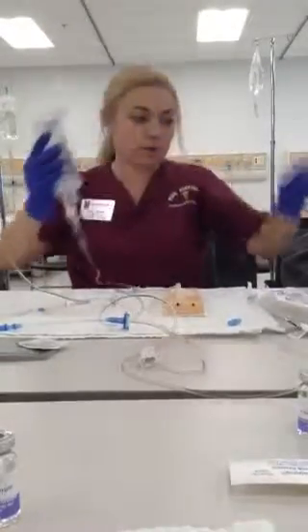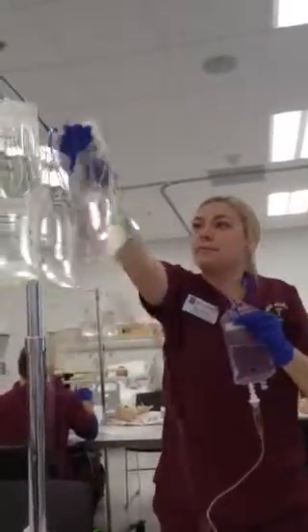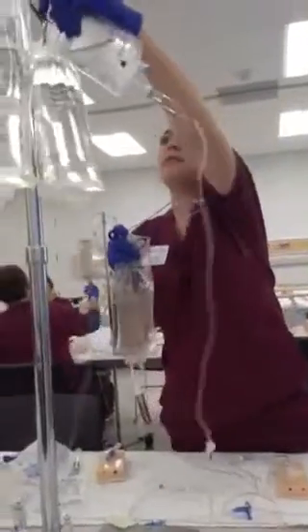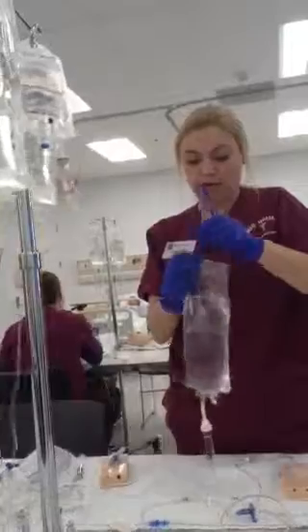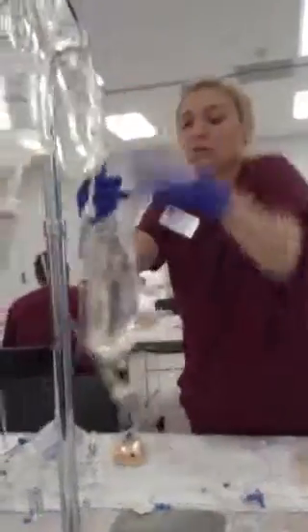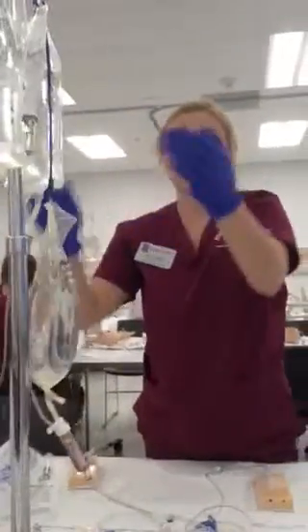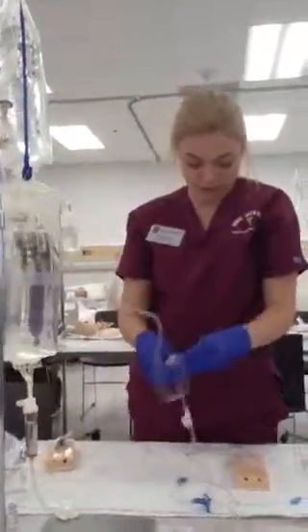Okay. I'm going to want to make sure that my IV saline is hung lower than my piggyback medication. So I'm going to hang this up here. And then hang this on a hook. It drops it lower, so the IV medication, so my antibiotic is going to flow into my patient first.